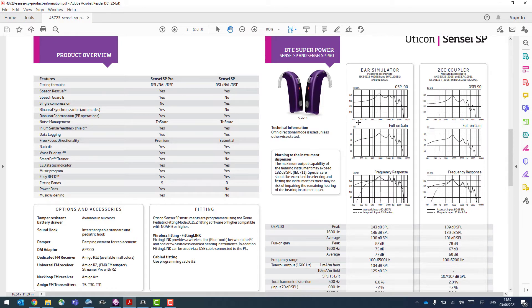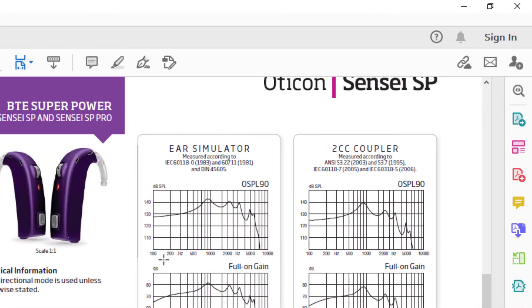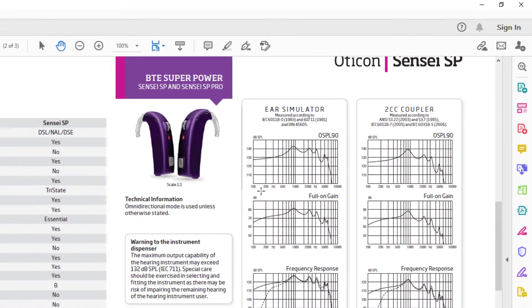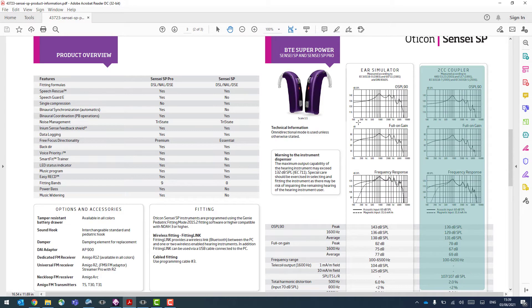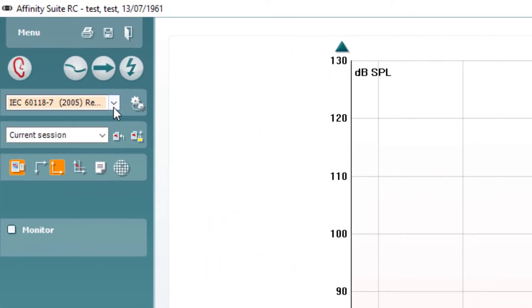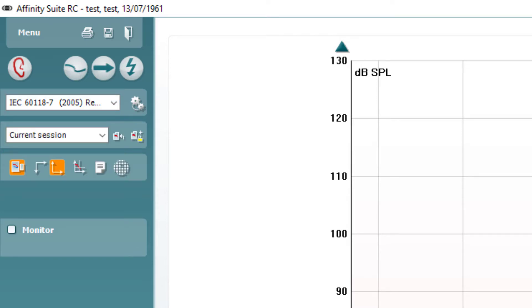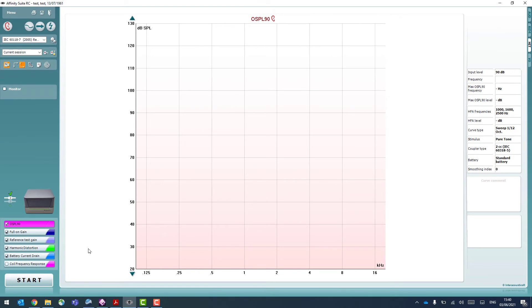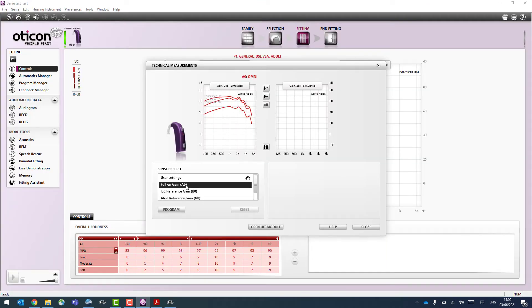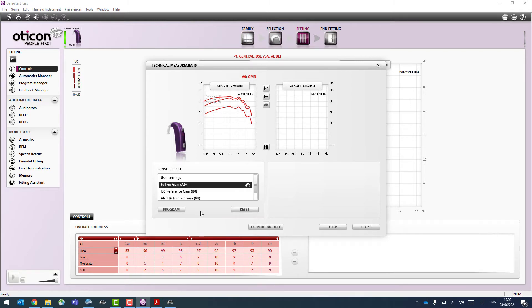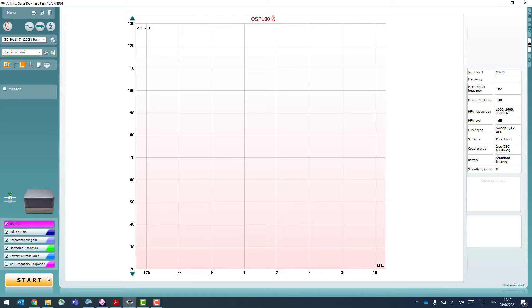We want to use a 2cc coupler and the relevant protocols. In this example, I'll use an IEC 60118-7-2005 protocol with a 2cc coupler, and I'll select a reduced protocol in the Affinity software. Ahead of pressing start, I need to go into the hearing aid software and make sure it's set to full on gain, programming it to that specification so I can compare its performance against the spec sheet.